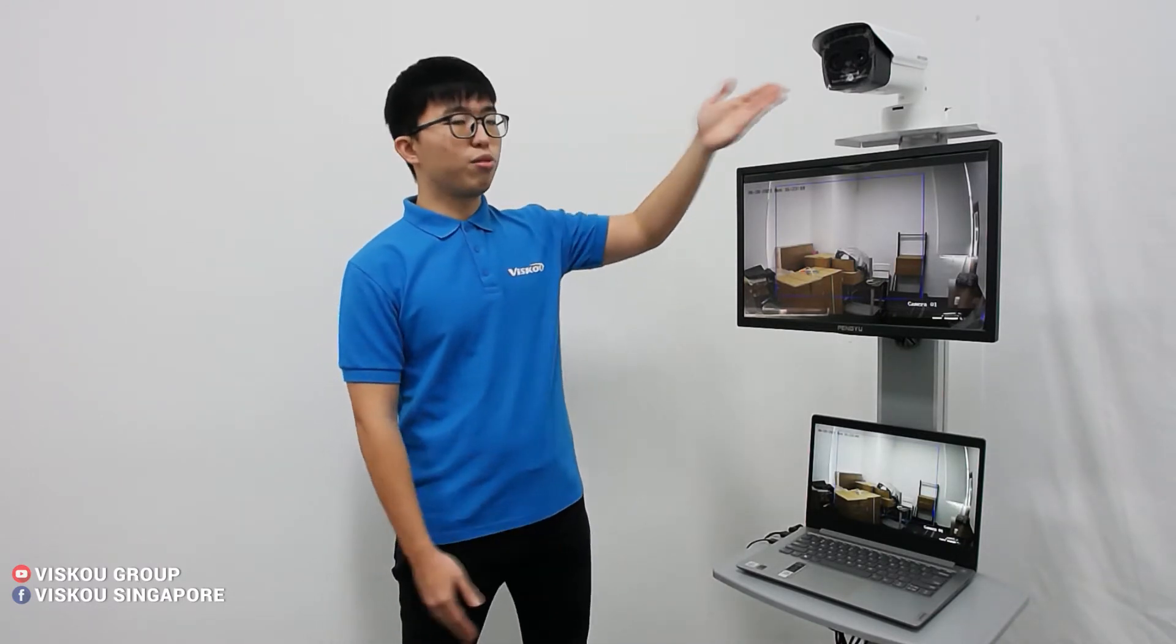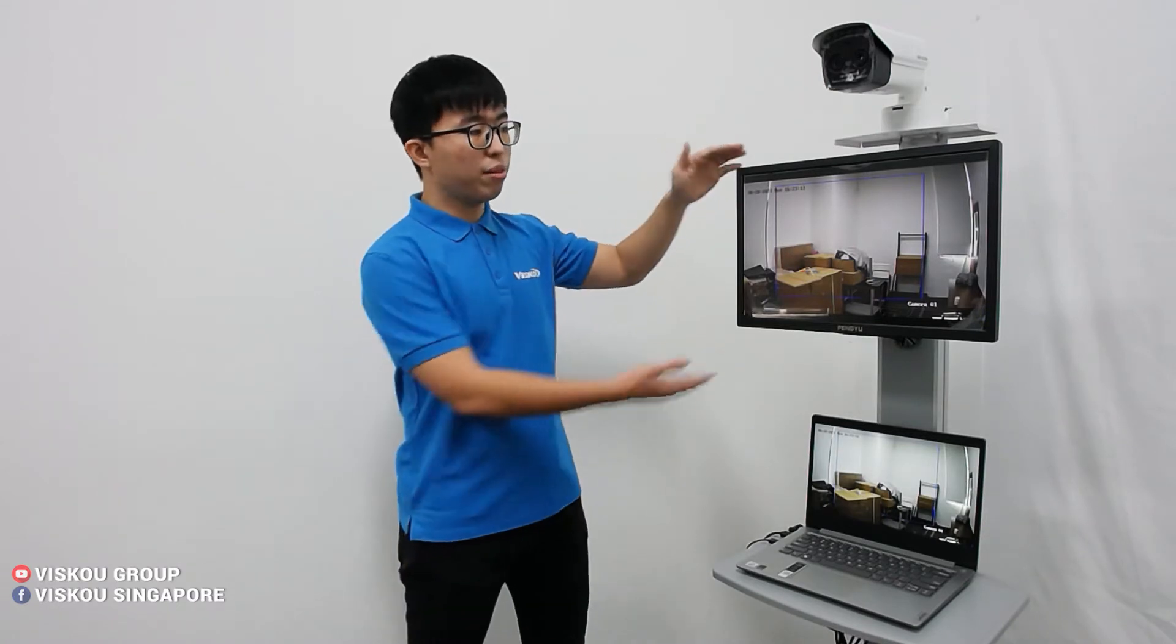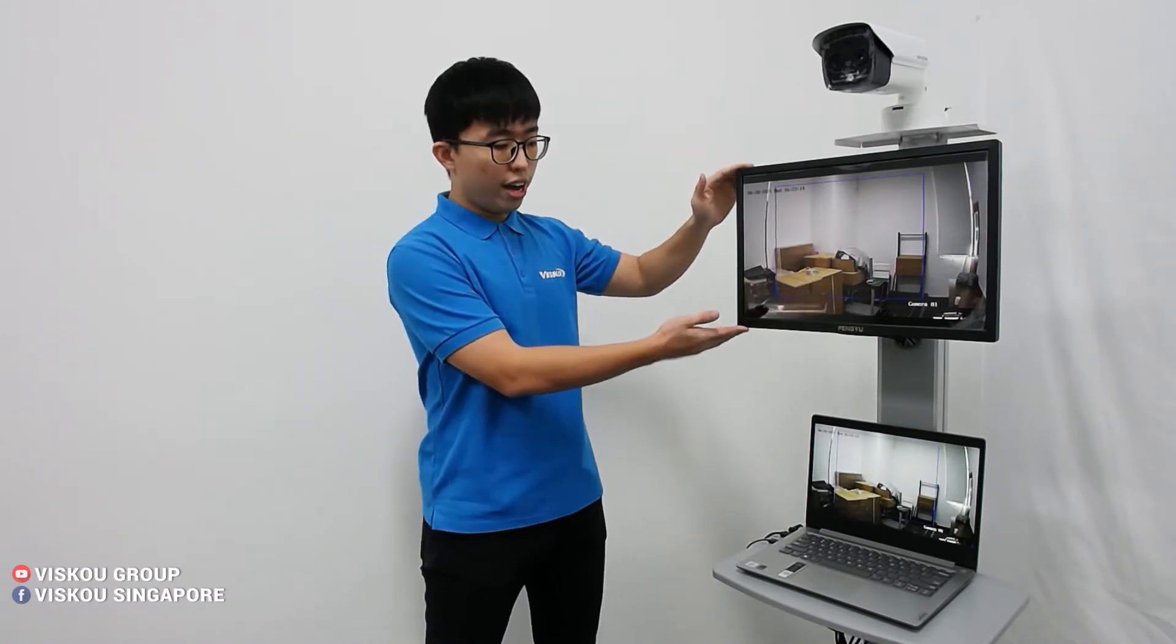As you can see here, this is the whole stand we made for the S2617 camera. We have the monitor and also here is something to put your laptop or PC. So now we are using a laptop.